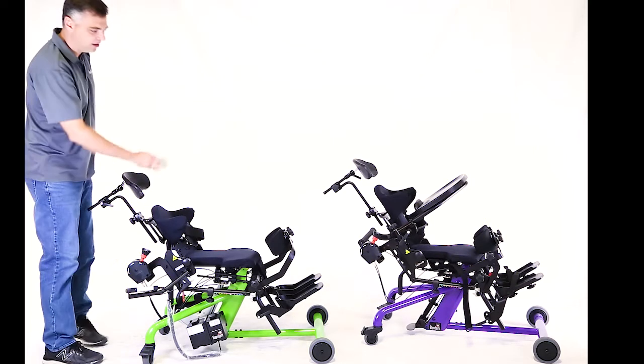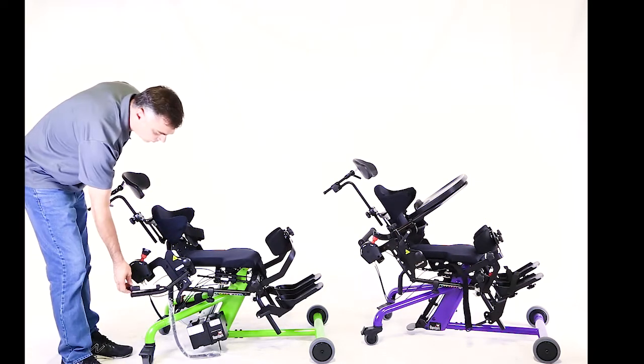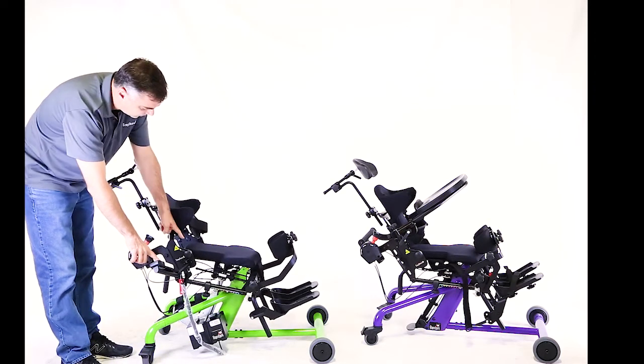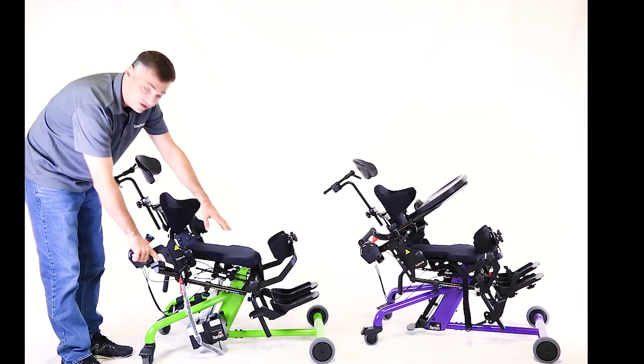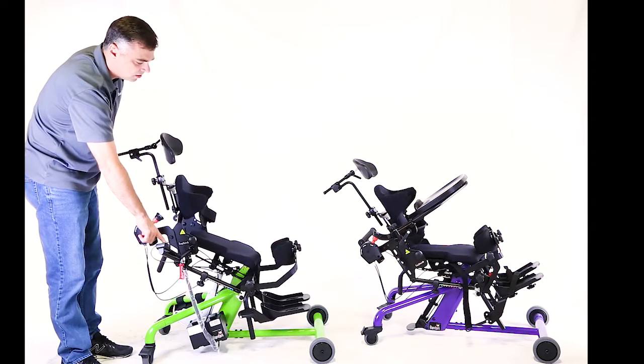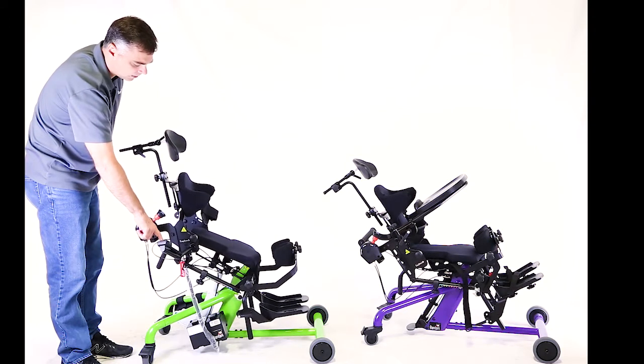I have both of these Bantams set into the supine option. When we go from sitting to standing in supine, you'll notice that the hip angle isn't changing and the knee angle isn't changing. So I'm just loading weight, but I'm not changing position. And I can go right until my feet go flat to the floor, back and forth.